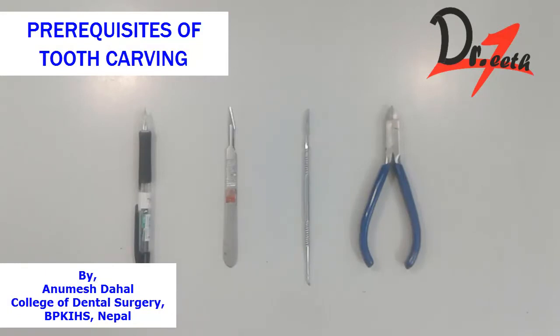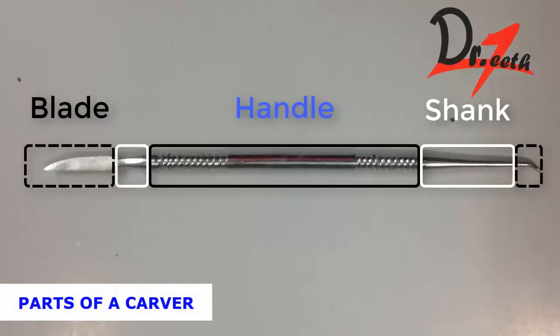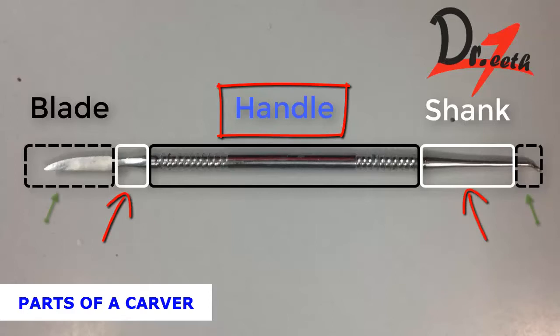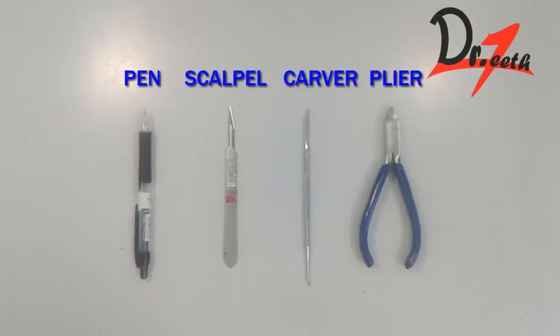Today I will show you how to select the carver and grasp it in a proper way, and the prerequisites for carving a tooth. First of all, we will know the parts of a carver. It has a shaft or handle, two shanks and two working ends. Handle is which we grasp, working end is the blade and shank connects the blade and the handle.